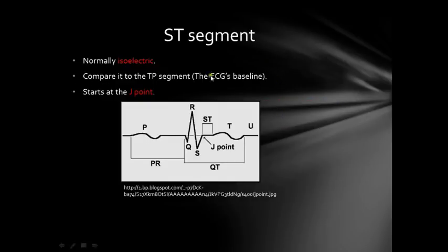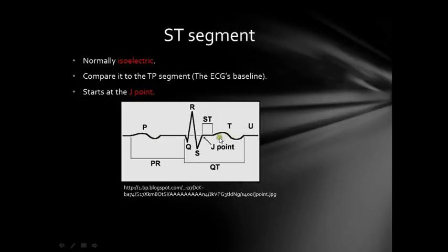The sixth thing is the ST segment — it is called a segment, not an interval. Normally it is isoelectric, starting from the J point, which is where the S wave ends and the ST segment begins. The ECG's baseline for comparison is the TP segment — the flat region between the T wave and the next P wave. You can see the ST segment is at the level of the TP segment — this is a normal ST segment.